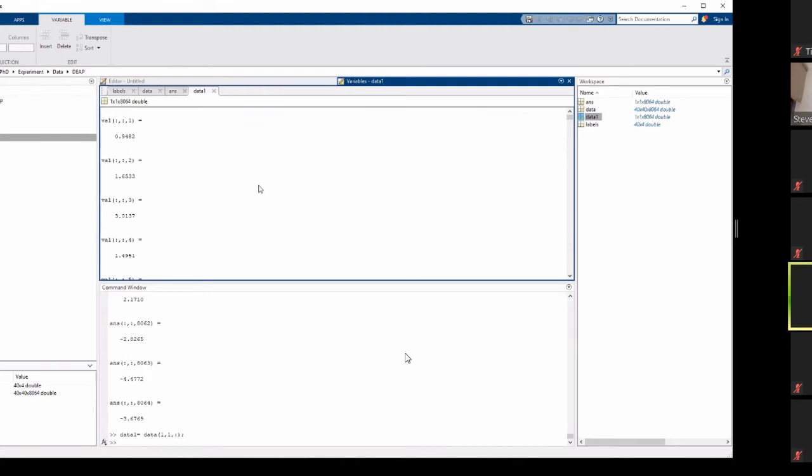I think you can start to read that paper about how they did the experiment and download the data, try to do the things that we did in stage 1 and 2 using this data set, and see whether you can do your spectral analysis and find the alpha, beta, theta band of this EEG signal. So you use alpha, beta, gamma as a feature. I think that's the first step of the feature extraction, the first step after the spectral analysis.